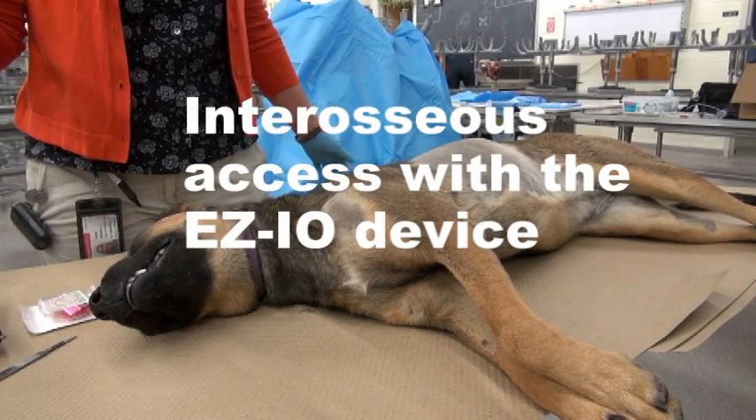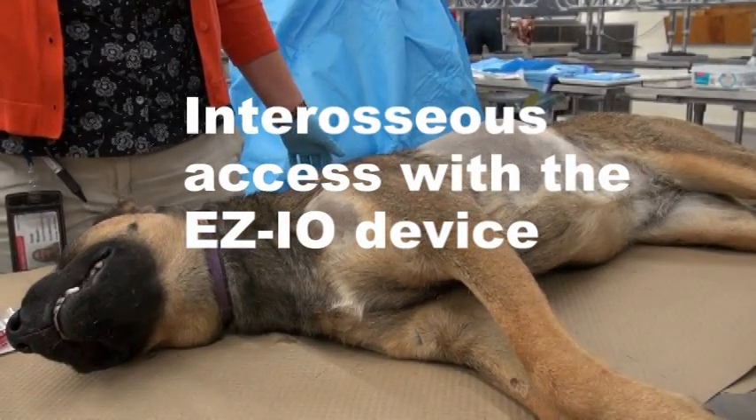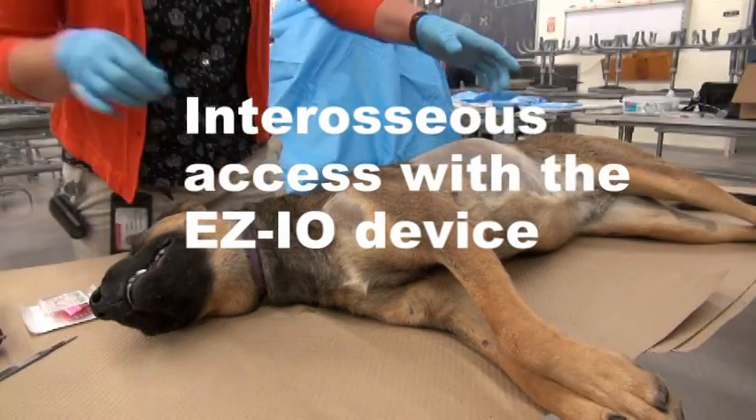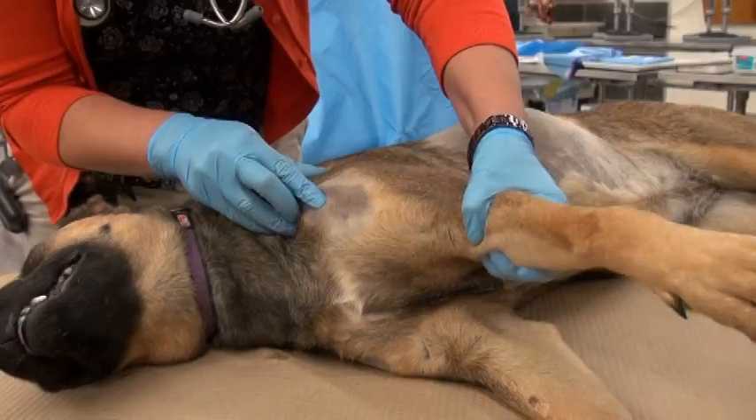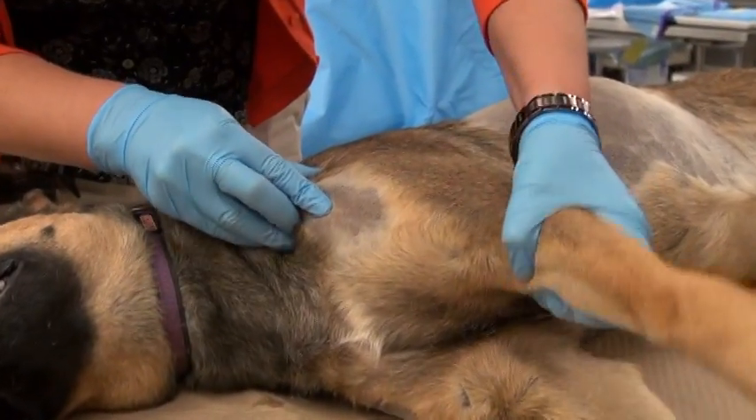This video will demonstrate interosseous access with the EZIO device. In a large dog, we typically choose to catheterize the area of the greater tubercle of the humerus, which we've clipped in this demonstration.